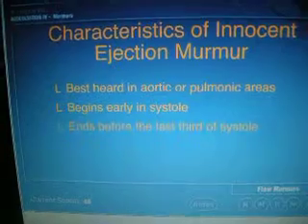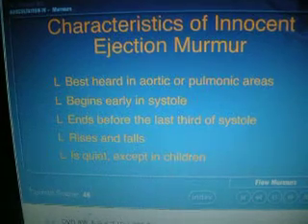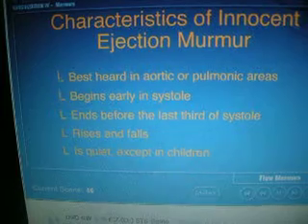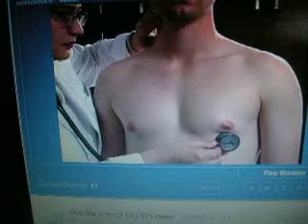Characteristics of this murmur have been described in your second lesson and include... listen to and diagram these 2 murmurs.